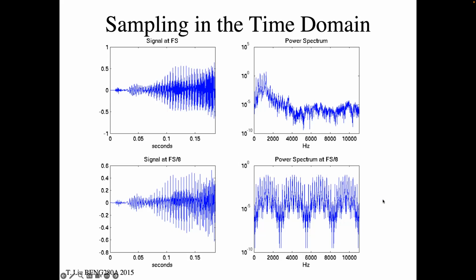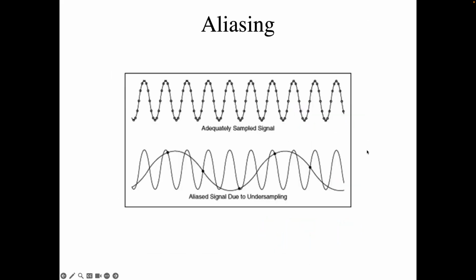And so if you needed frequencies up here, you're out of luck, right? This is called aliasing, and it comes from undersampling, by not sampling high enough to detect frequencies that are up here independently. So a visceral pictorial view of what aliasing is: if I have a high frequency sine wave and my sampling points are along here, this is what my signal looks like after I've sampled it. It's pretty obvious we've sampled this well enough to detect this frequency, because we have a very nice sine wave mapped out here. And so both frequency and phase, i.e. where the sine wave is on the time axis, are well sampled here.